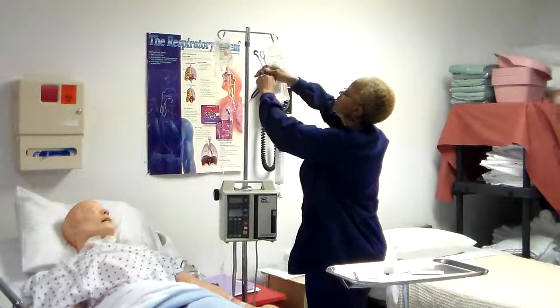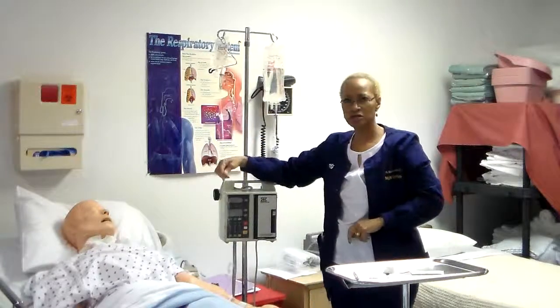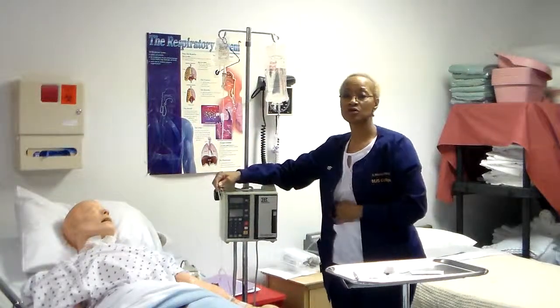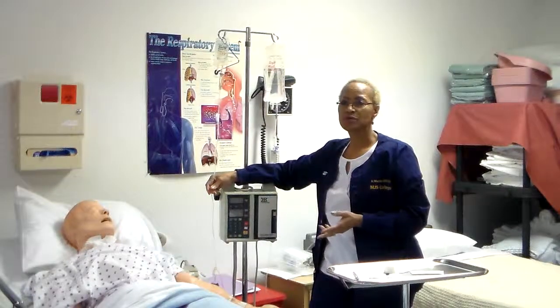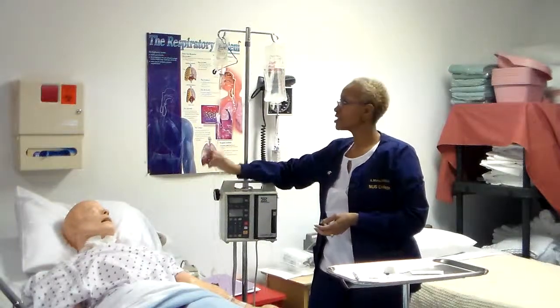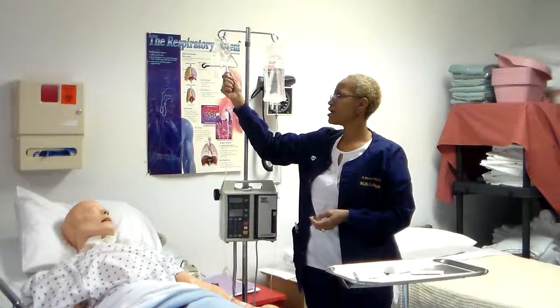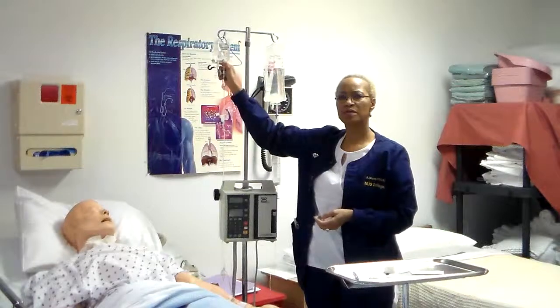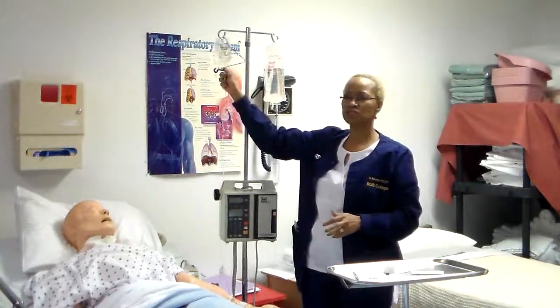hole. And then you can just leave this there. You don't have to take down your tubing every time. It depends on the policy of your facility or the hospital. A lot of them leave it in place, and all they replace is the bag, especially if someone is getting an antibiotic or an infusion, a piggyback every 4 hours. Then there's no need of throwing this tubing away. All they do is change the bag, okay?